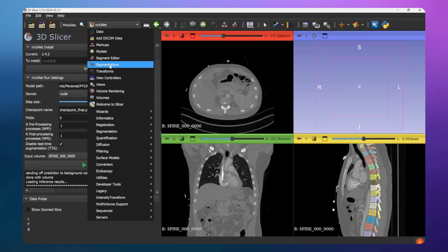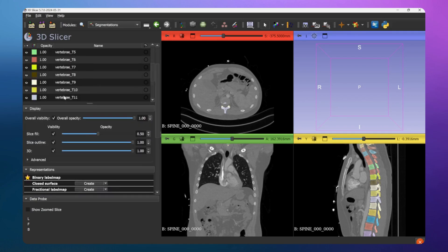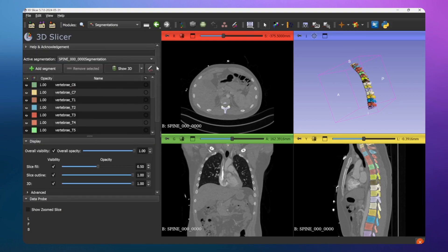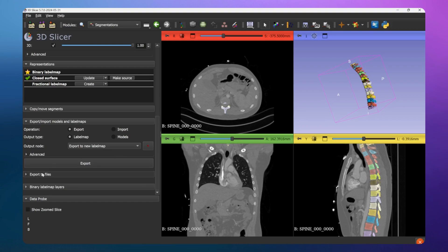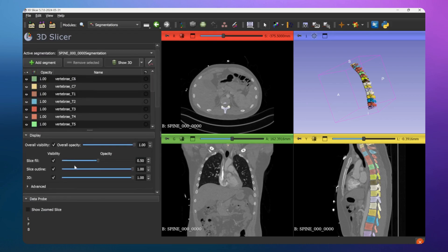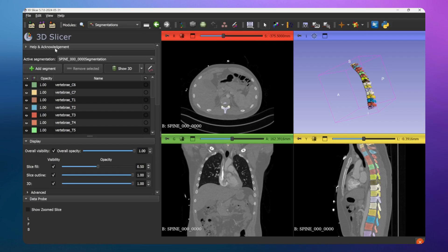Go to the Segmentations tab - which is installed by default in 3D Slicer. You will find all the segments predicted by your model listed there. To view in 3D, click Show 3D and the 3D output will be displayed. If you want to edit it, go to the Editor and correct whatever you want. When you're happy with the output, go to Export, choose the directory and file format such as NIfTI, and export it.